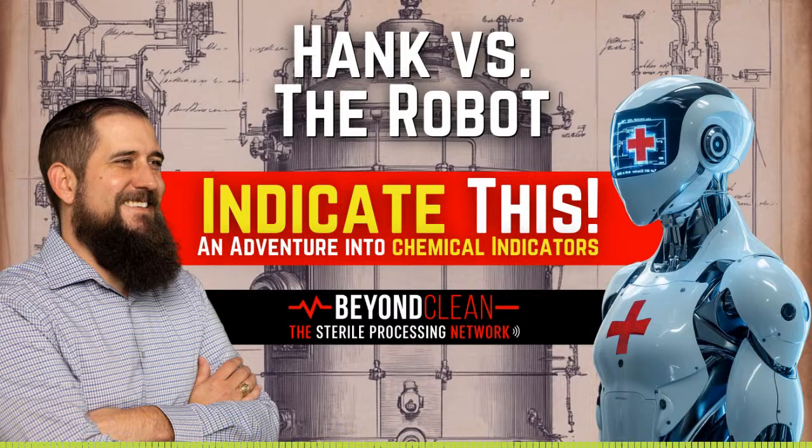Affordable and accessible. Visual and intuitive for frontline staff. Limitations: they don't confirm the actual kill of microorganisms. Prone to subjectivity, especially with color changes. Biological indicators. These are the gold standard for confirming sterility because they test whether the sterilization process killed live microorganisms, typically bacterial spores. They take time, usually 24 to 48 hours, but give the highest level of assurance. Strengths: definitive proof of microbial kill. Essential for high-stakes loads like implants. Limitations.